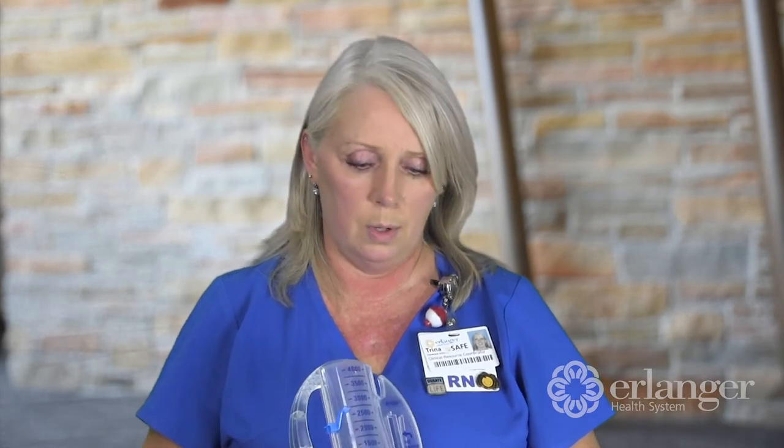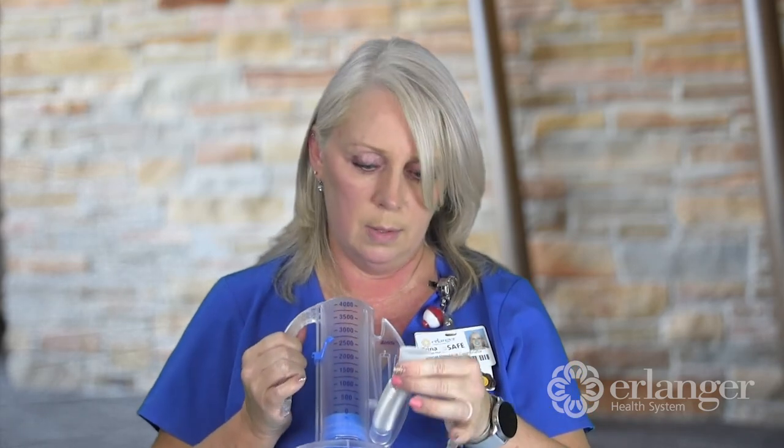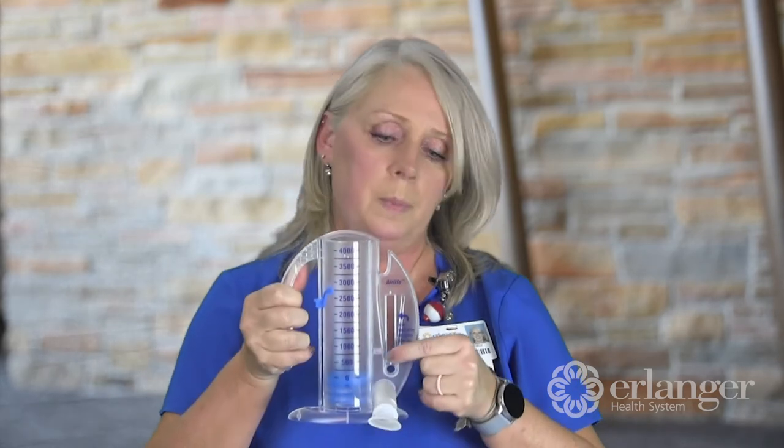You should perform at least 10 breaths every waking hour. To do that, the little mouthpiece will go into your mouth and you'll take a slow, deep breath, and there's a little indicator that you're going to want to hover in the middle of this.